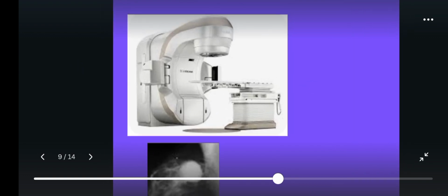It is a costly machine. It is used to kill cancerous cells in cancer patients. It has some advantages. One is that it can cure or prolong the life of a cancer patient. Then disadvantages of this machine include that it uses radiation and therefore causes harmful effects. It can kill or affect nearby normal cells during treatment. It is also very costly and not easily available.